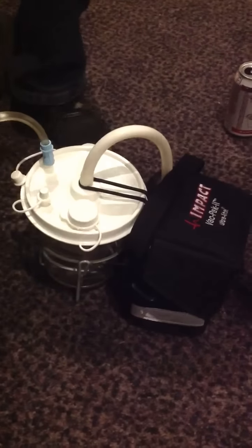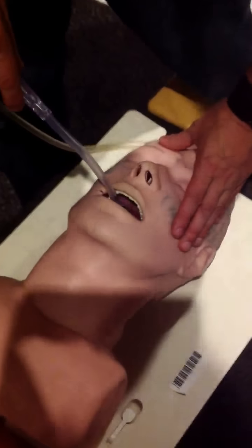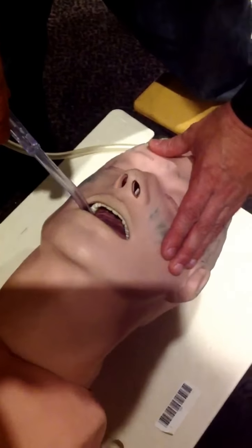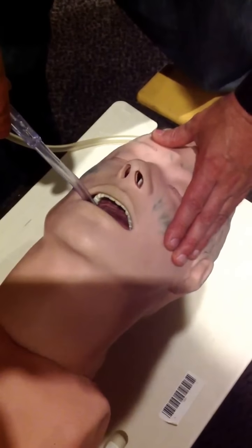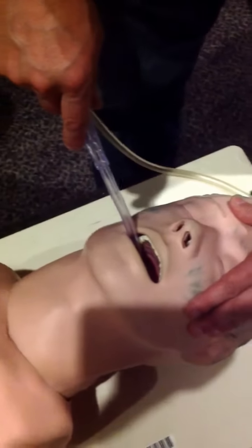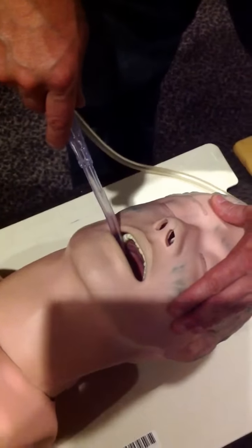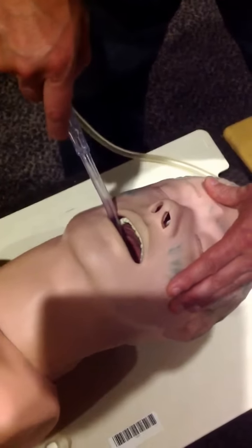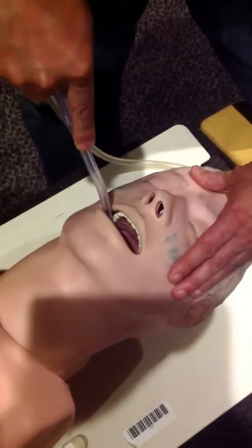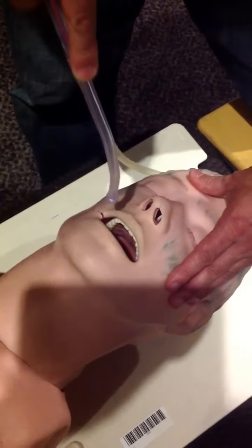When you're actually suctioning, you have to make sure to suction only on removal. So you insert the tip without your finger covering the hole, and you want to make sure you don't insert it any farther than you can see, because you want to have control of what you're suctioning, and if you push it in too far, you might stimulate the vagus nerve, which could slow down the heart rate. When you're ready to suction, cover the tip, and then slowly remove the suctioning device.